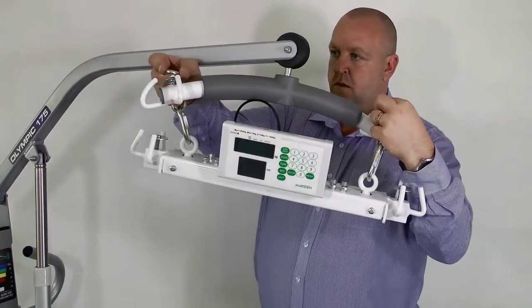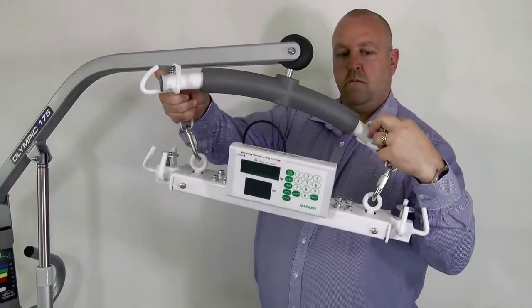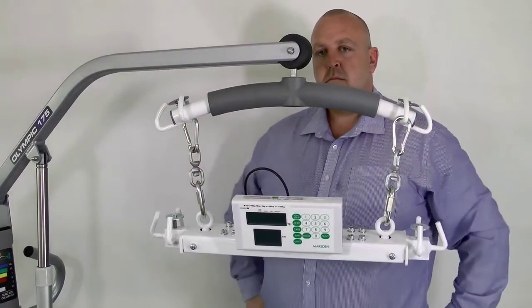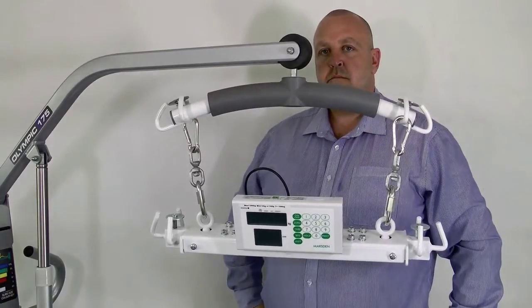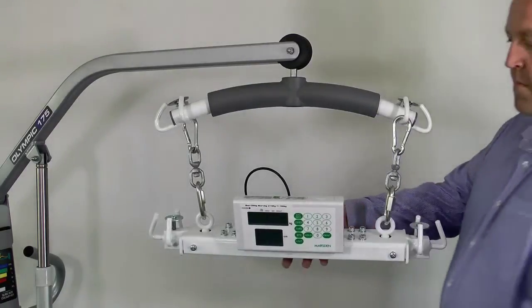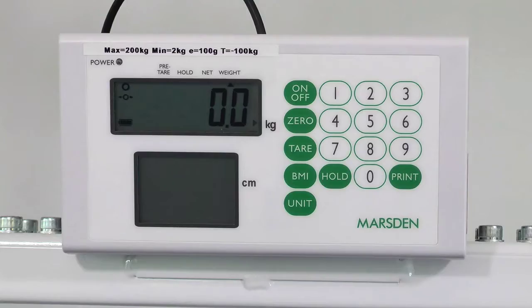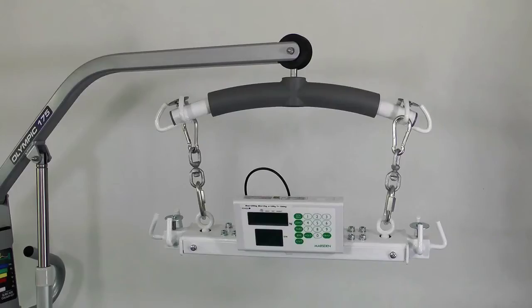As with all hoist scales, it's essential that you correctly attach them to the hoist. Firstly, attach the M600 to the hooks or links on the spreader bar using the links provided. Turn the scale on and check the display shows zero. If it doesn't, then press the zero button. The scale is now ready to be used.